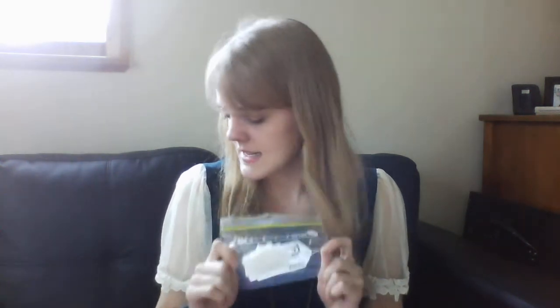So I just grab one of those wipes at a time and cut it up into little pieces. Make sure that you've washed your scissors and that there's no residue on them from anything else, and that you've washed your hands. Beyond that, they're fantastic, and will give you a true reading if you have your fingers clean.